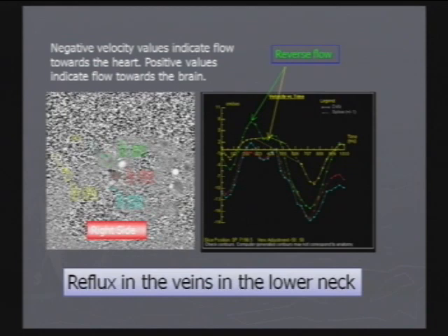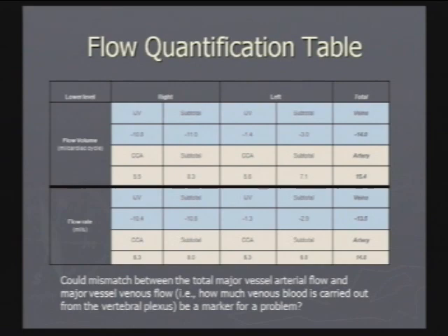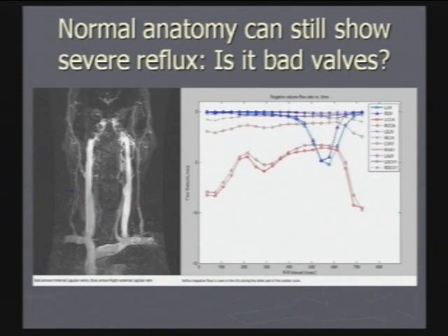And we create from this a nice table that then gives me total cardiovascular input output, and so these are some of the numbers you can get. But maybe the functional part can do even a little bit more than that.